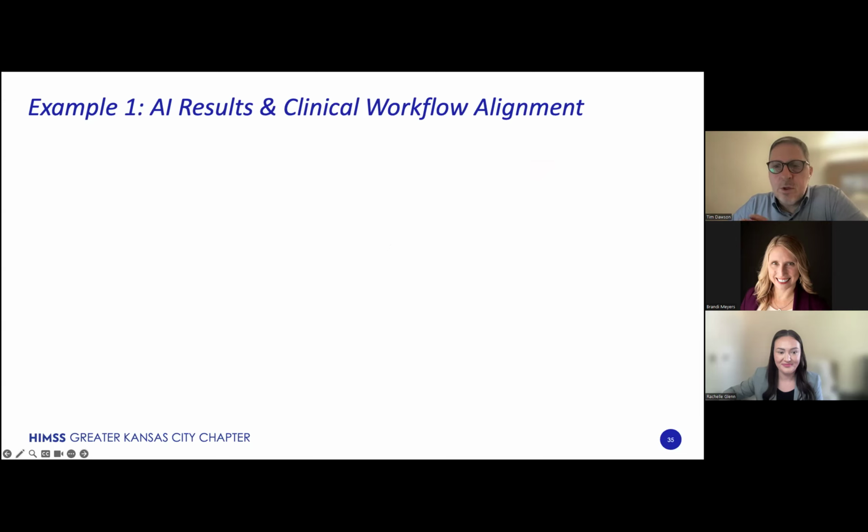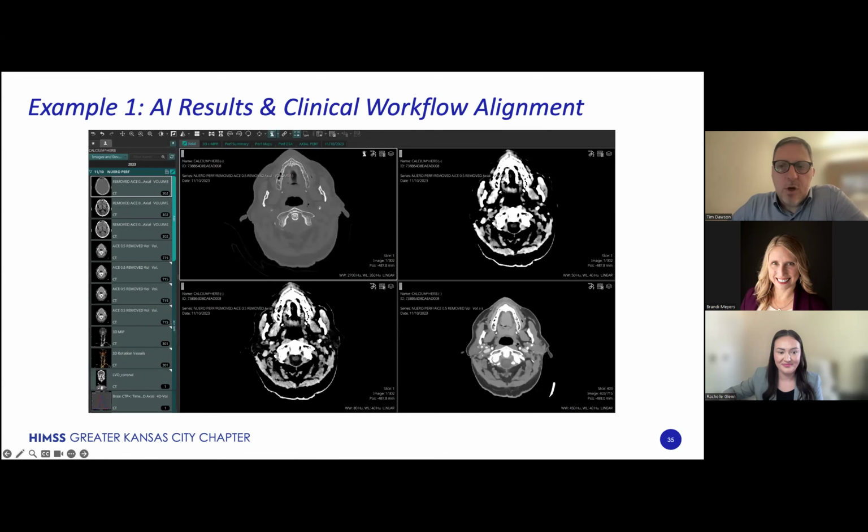So here's what this can look like with a stroke case. We can create a hanging protocol for review of the images. Now, for those who don't know what a hanging protocol is, back in the old days of film, they would literally hang the images one by one in a certain order so that the radiologist could come in and take a look at the images in a consistent way and be able to make their diagnosis. We do the same thing today on computers. It's just all electronic.